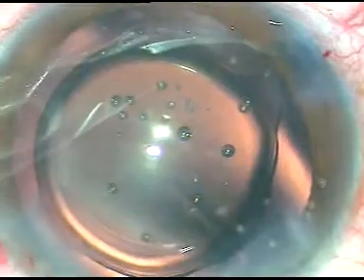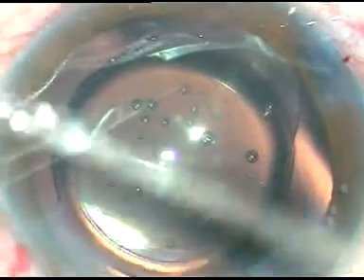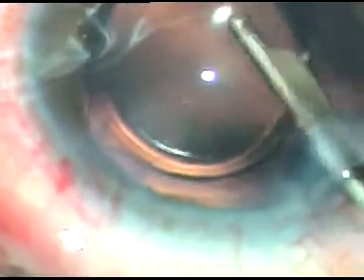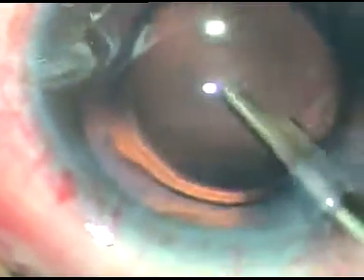Now is the time to remove the viscoelastic substance. This is the direct Simcoe cannula. Again, at this time I am flushing out the viscoelastic substance from the front or now from the behind of the intraocular lens, and almost 90% of the viscoelastic substance is removed by the Simcoe cannula.